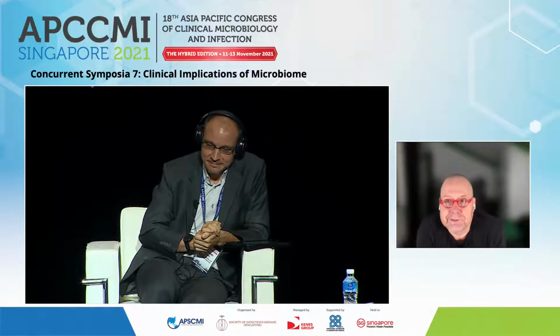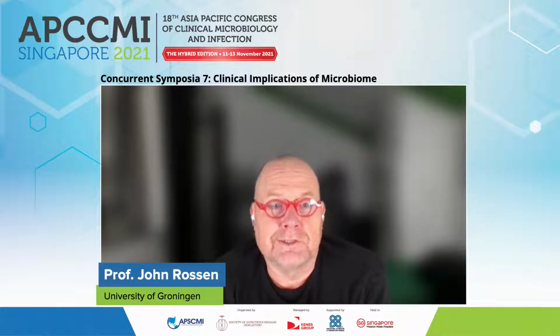Yeah, thanks for this interesting question. Obviously, that is a possibility. However, that will introduce a bias again, and that is actually what we want to try to get out of the diagnostic process. So, if you do a culture step, then you are biased to those samples that are viable and easily culturable. So, for example, TB takes a long time to culture, versus Staph aureus that has a much faster replication cycle. So you will more replicate Staph aureus versus TB, and therefore you get a bias in your results.